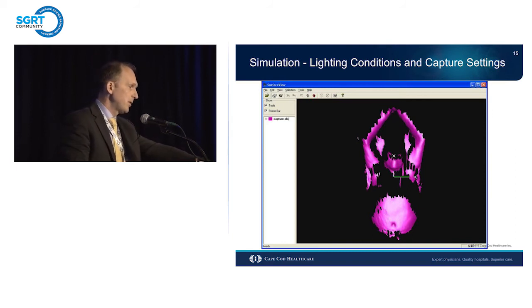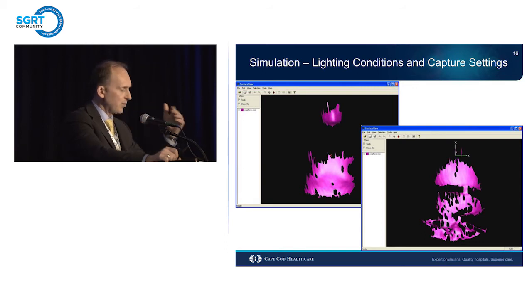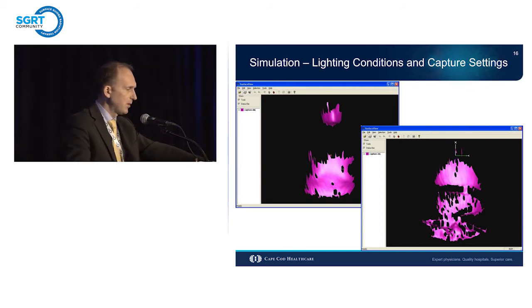Now, can this be used? Of course, because that patient might as well be a good belly breather. That's an area that you can place the tracking patch on, and you're going to be just fine. If this patient is more a chest breather, that's when trouble comes in. But most of them are moving underneath the diaphragm, where you would place your tracking patch. Here's another great example, just missing the data completely. On the right lower corner, you see must be some kind of a gown rolled up and left on the patient's body. So those things have to be moved out, of course. And again, adjust your lighting, adjust your capture settings, increasing those milliseconds or decreasing depending on the patient's skin tone.